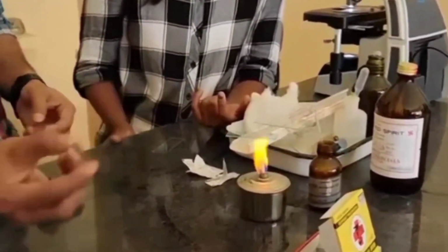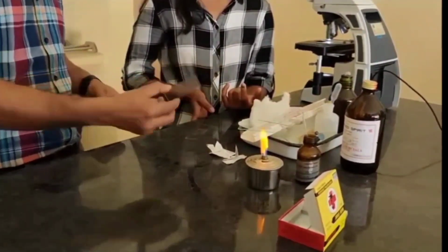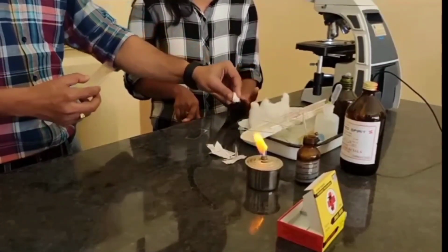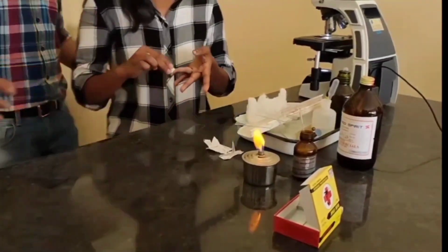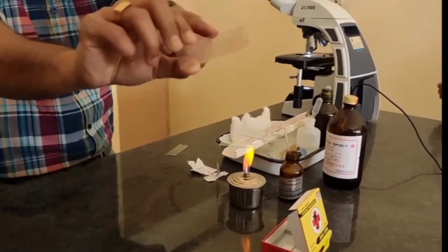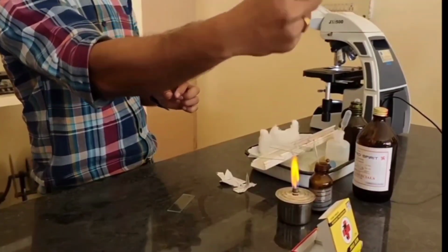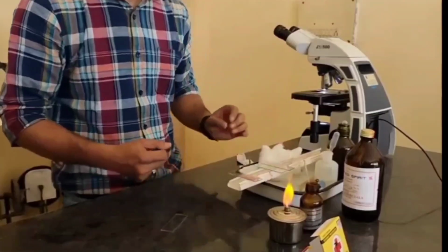And now I have to dry it immediately by waving it in the air. Why? Because if we keep it, it will dry, but it will take longer and there will be a chance of the blood cells shrinking and you will not get the cells at actual size. Size will change, morphology will change. So that's why we should always dry it by waving in the air immediately, as soon as possible. Let me show you how to dry it and make sure that your slide is completely dry.